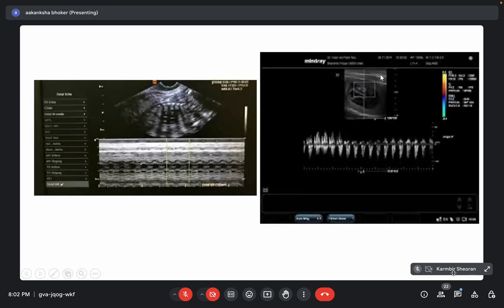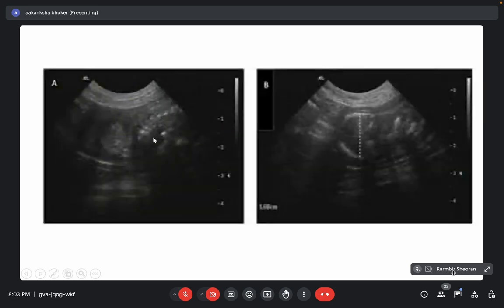And next, by x-ray we can know the exact number of fetuses present within the abdomen, but we cannot be sure whether these fetuses are alive or dead. Whenever performing sonography, we can identify a dead fetus. A live fetus will be surrounded by fluid, but in the case of a dead fetus, this fluid will be abolished. There will be no fluid, and emphysema may also start, and it may start getting macerated. So these are dead fetuses.